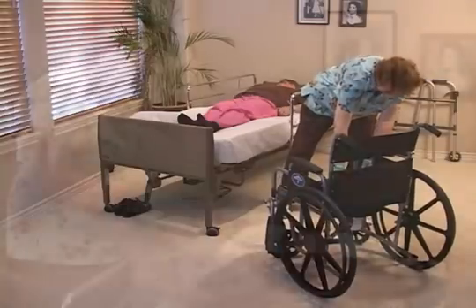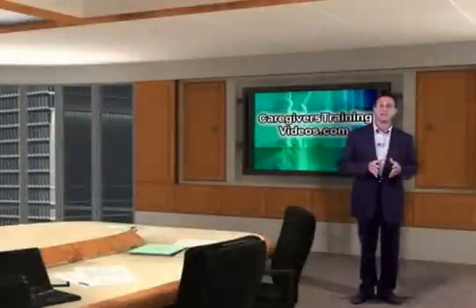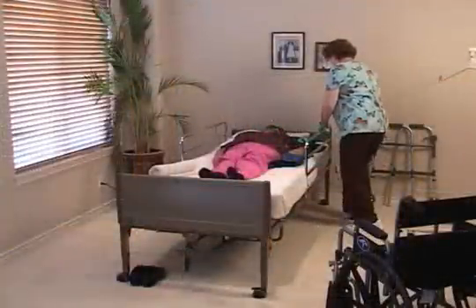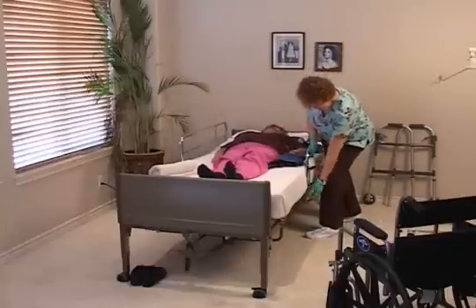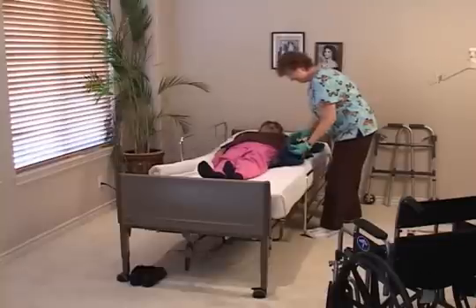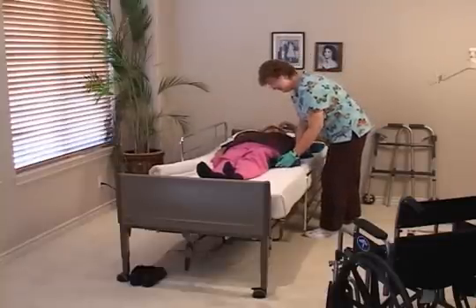Third, then explain to the resident that their body should be shifted from one side of the bed to the other so that the sling can be positioned for the lift. Fourth, always lower the bed rails on the transfer side. Fifth, then position the resident to the center of the bed. Sixth, fold the sling in half and place the sling next to the resident. The top of the sling should be at the shoulder height.